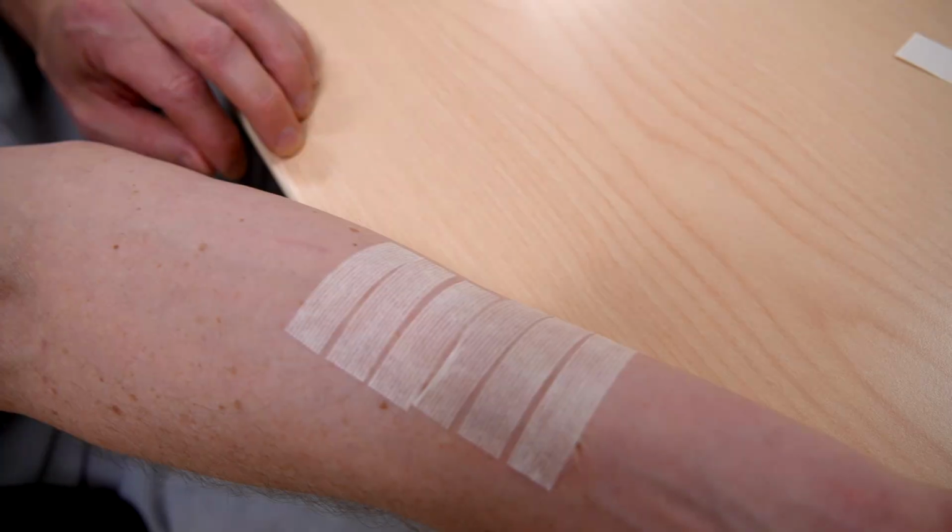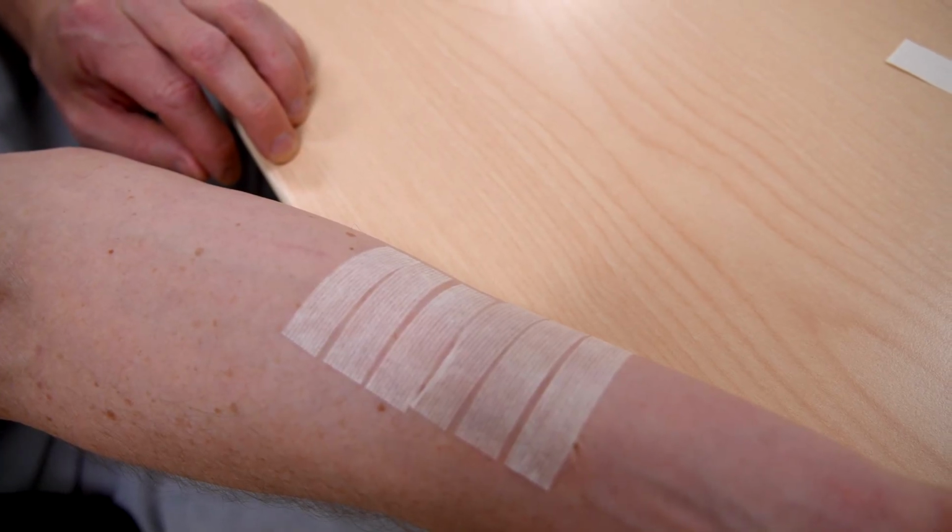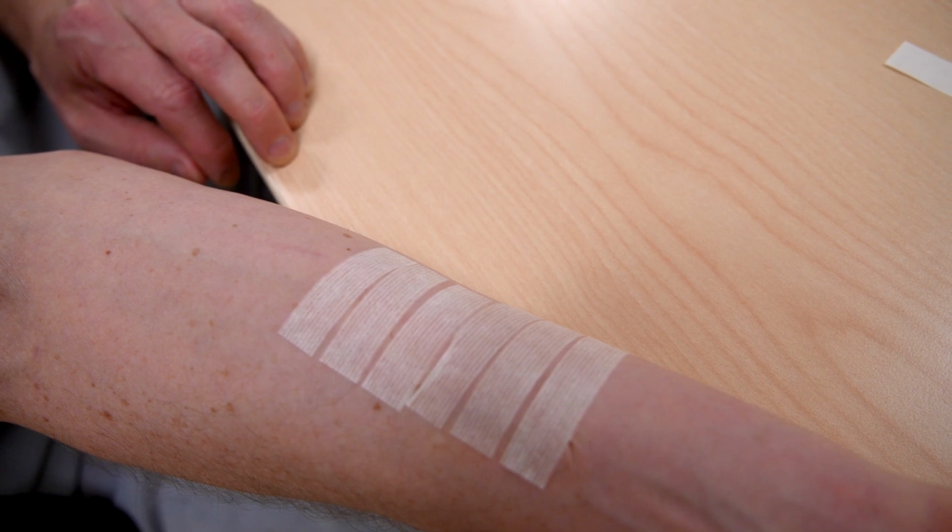Your surgical dressing should stay on for 3 to 5 days according to the directions from your doctor, and afterwards it can be left open to the air. Underneath the dressing, there will be small pieces of tape called steri-strips. These can stay on until they fall off on their own, which usually takes about 7 to 10 days. Your incision will be stitched closed, and the stitches will dissolve on their own.